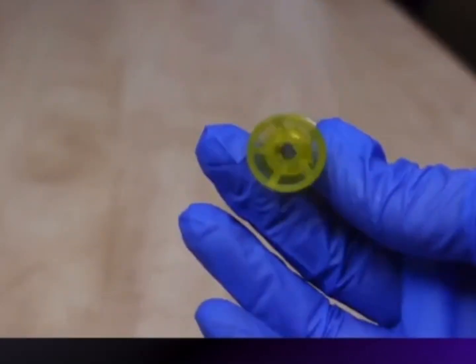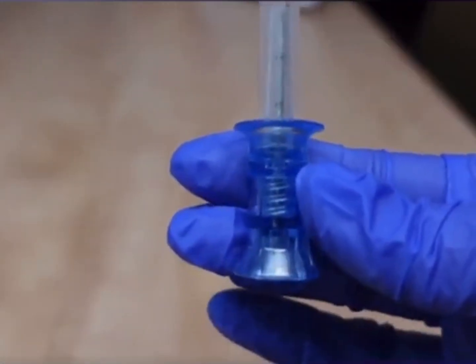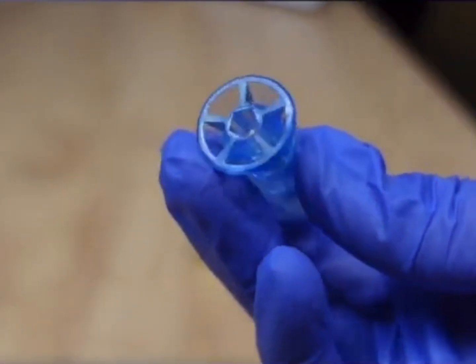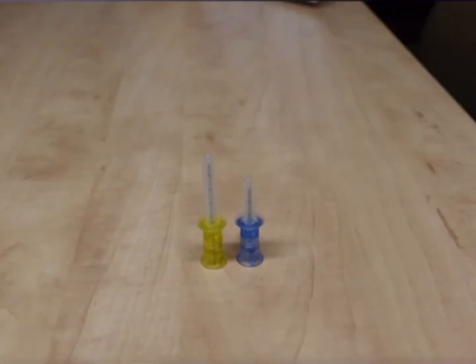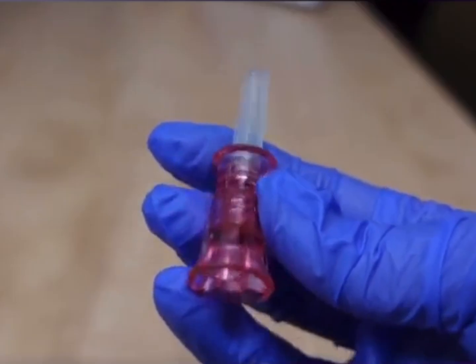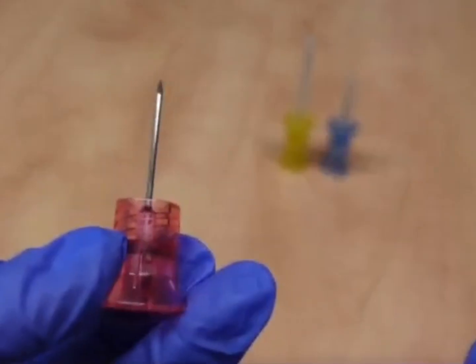So you see here the 3 sizes. You're going to see the yellow, you're going to see the blue, and you're going to see the pink. So when we go over the pink, you're going to see here the components. So you have the stylet, you have the hub, and then you have the catheter.